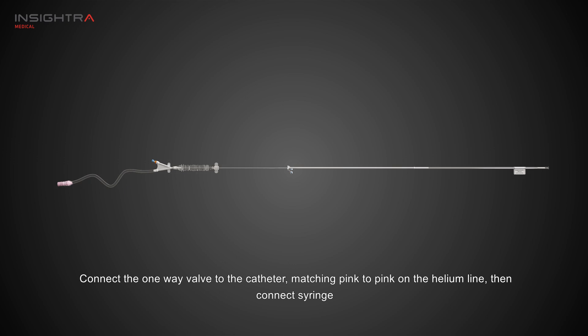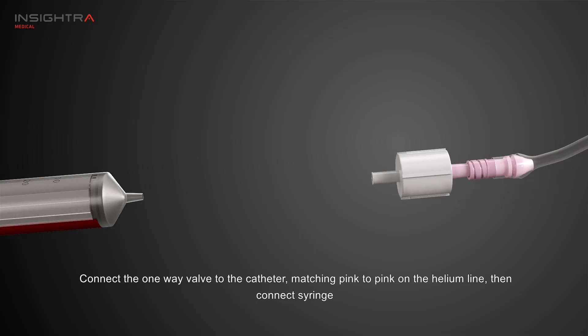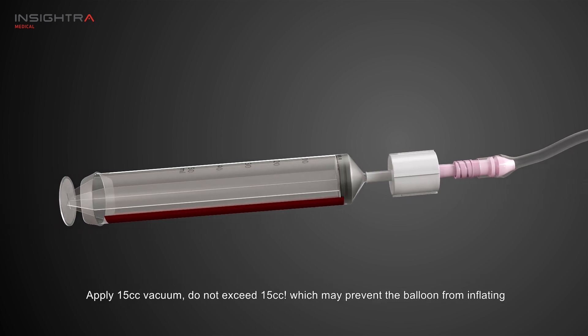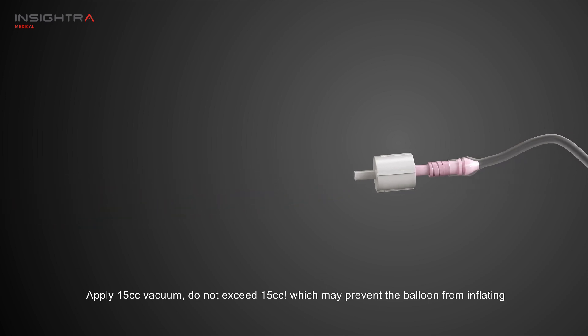Connect the one-way valve to the catheter, matching pink to pink on the helium line, then connect the syringe. Apply 15 cc vacuum — do not exceed 15 cc, which may prevent the balloon from inflating.